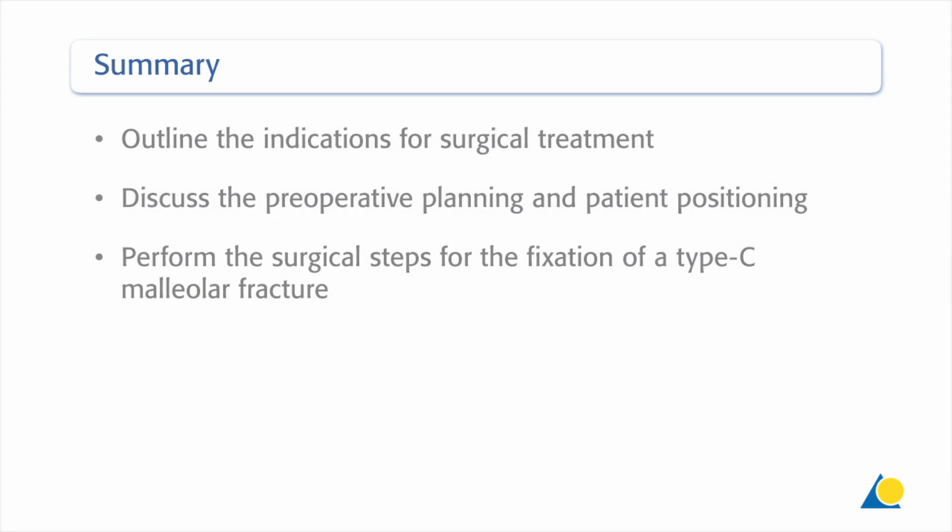You should now be able to outline the indications for surgical treatment, discuss the preoperative planning and patient positioning, and perform the surgical steps used for the fixation of a type C malleolar fracture.